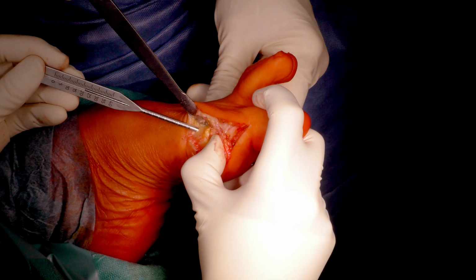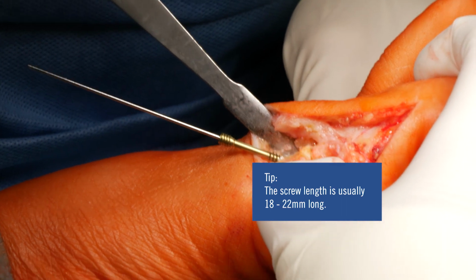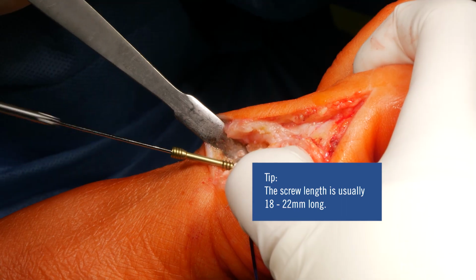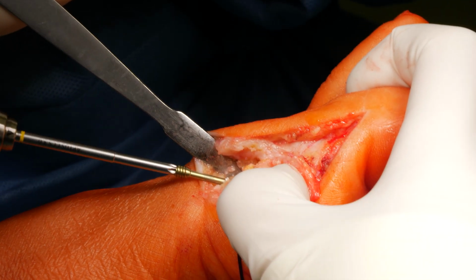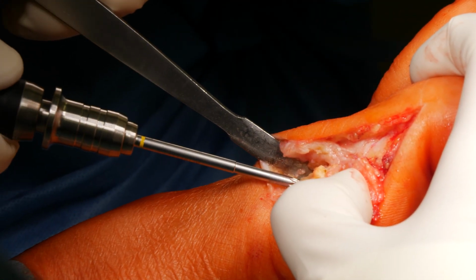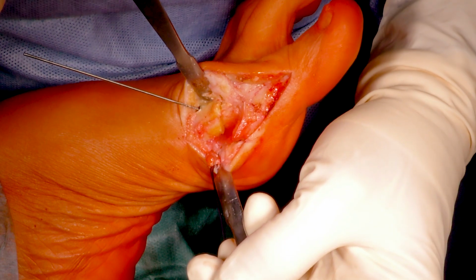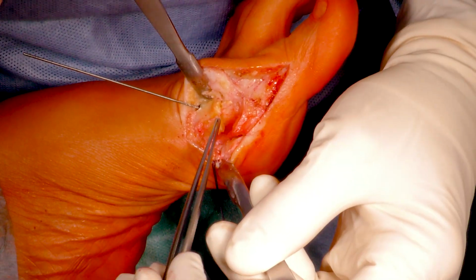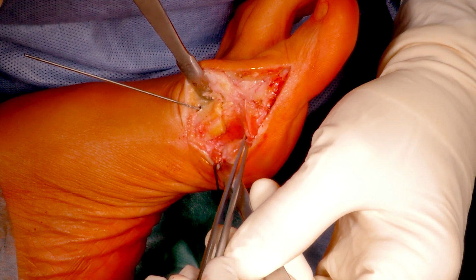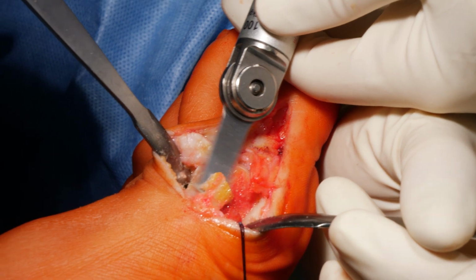Screw length can be measured. In general, a length of between 18 to 22 millimeters is needed. Drilling is not necessary in most cases. The screw is slid over the K-wire and inserted with a screwdriver. Compression begins as soon as the head threads into the upper cortex. The overhanging bone is removed with a saw.